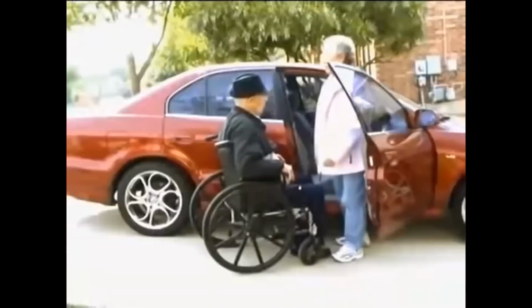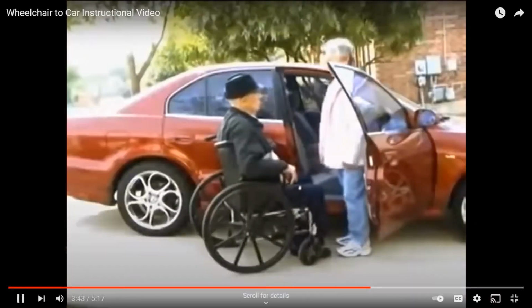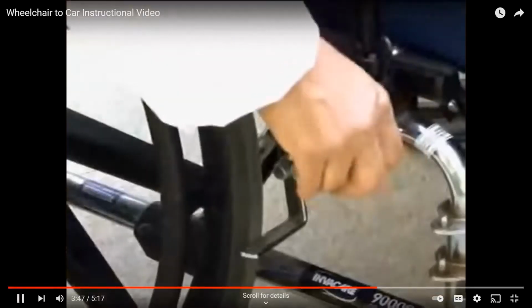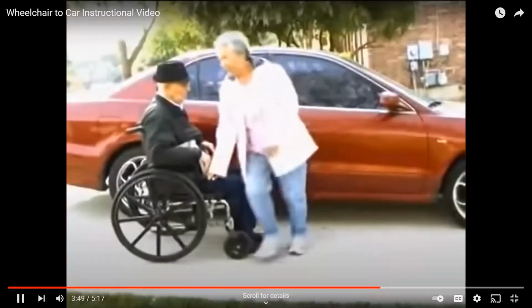If your loved one's legs are not strong, you can block their knees with your knees while they stand up. Guide the person to pivot and turn with small steps. Have them reach back for the armrest and sit in the chair when they feel the back of the chair. When your family member is comfortably seated in the chair, place the footrest back in the original position, unlock the brakes, and you are ready to go to your destination.